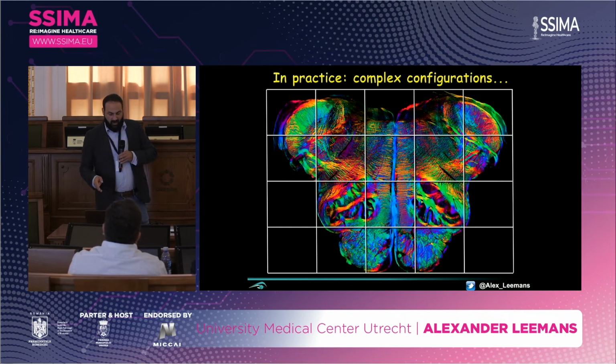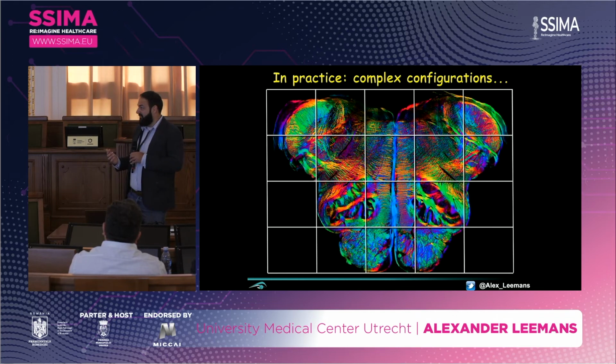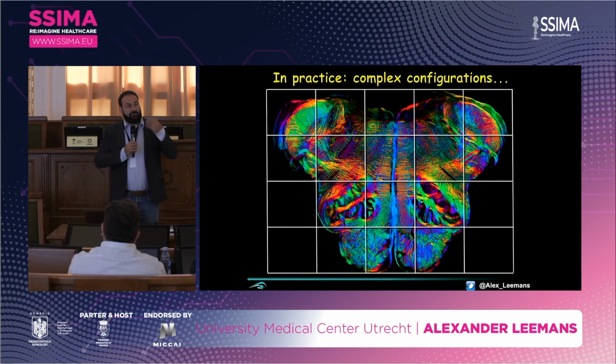And you can now appreciate how complicated this network of fiber pathways in the brain is, right? So within a voxel, you've got many pathways going many different orientations. And so conceptually, you can already appreciate that an ellipsoid is never going to catch the richness of the multiple orientations present within a voxel with the resolution that we acquire with diffusion MRI.